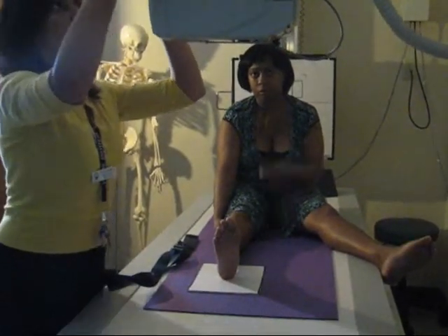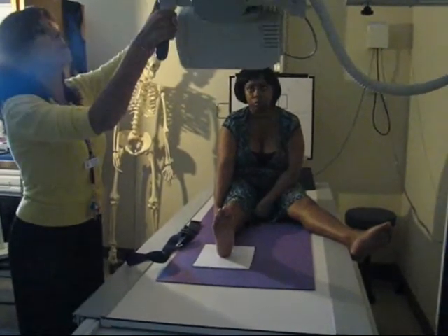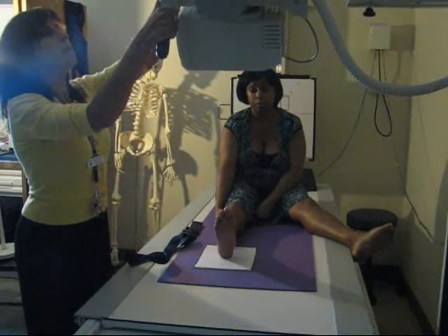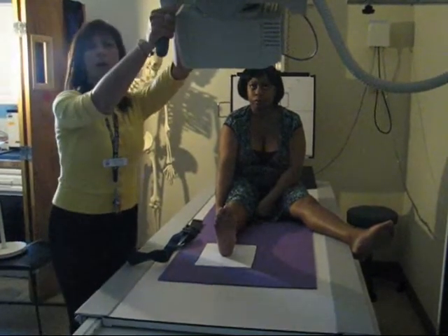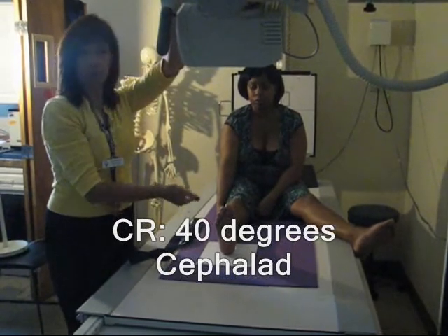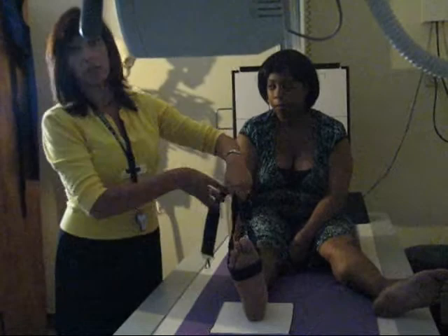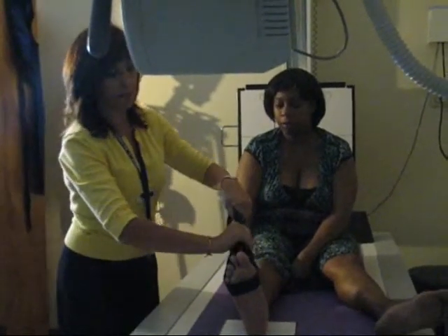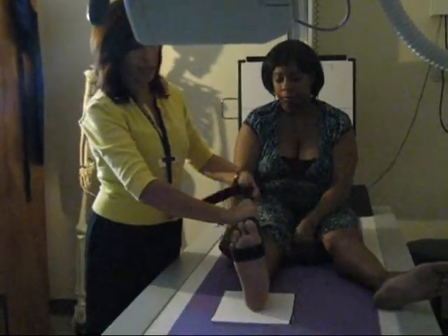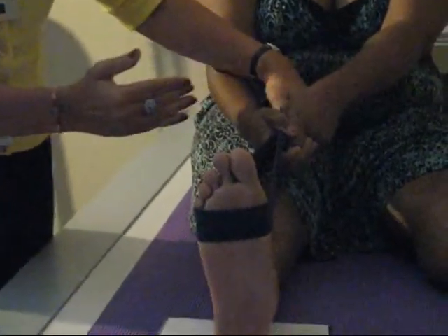So, you're going to angle the tube, angle the CR, at 40 degrees cephalad, or towards the head. It's kind of hard for a patient to flex their foot that much, so we're going to ask the patient to bring their toes towards them as much as possible.